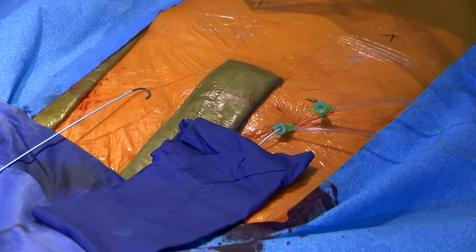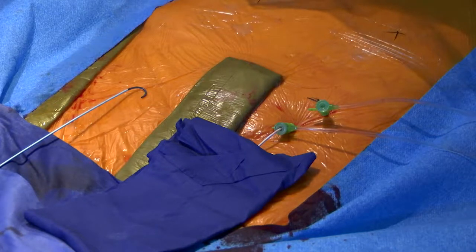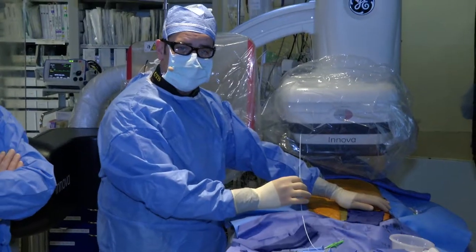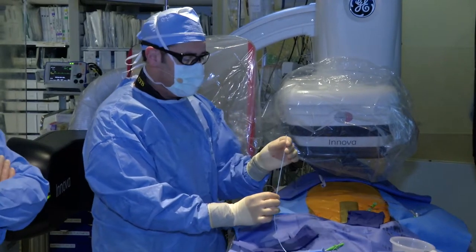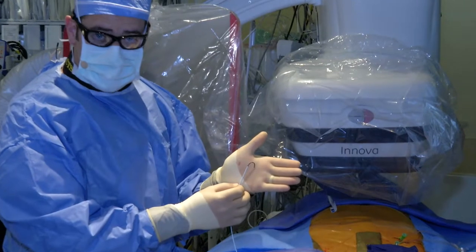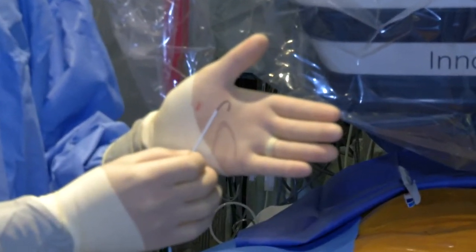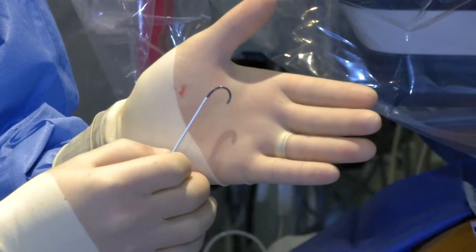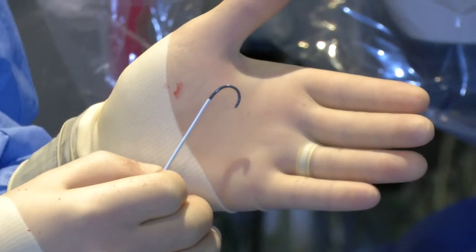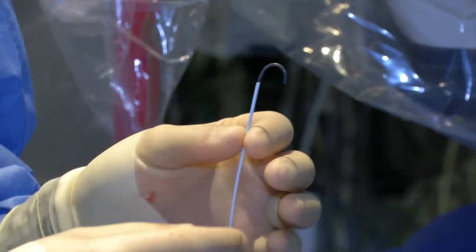So again, different sites and different operators do things differently, but we'll show you how we do things here at Scripps. What we do is get the non-TAVR access site first, and then we're going to use a simple crossover catheter. This is called a rim, if you can zoom in on that. It's just a little hook, kind of looks like an umbrella. And we're going to use this to go in from the left side, hook the other side, and then go around into the other side and directly visualize the artery, and we're going to stick the artery under direct visualization.